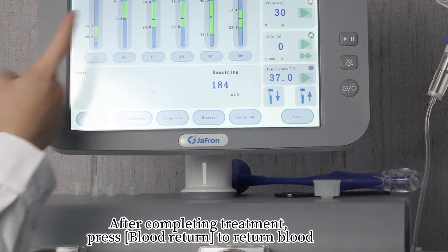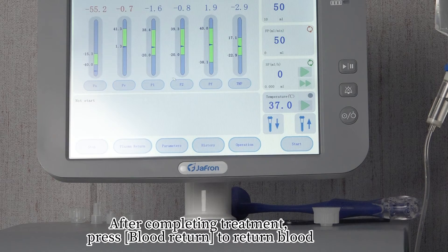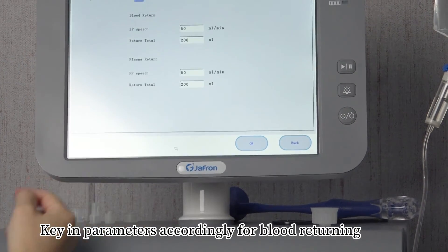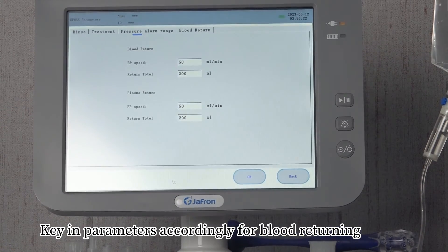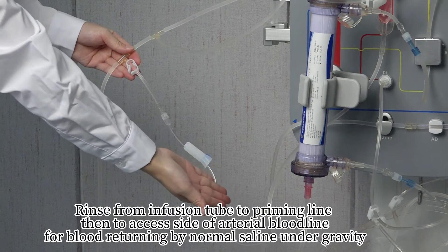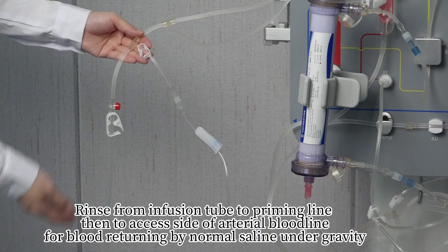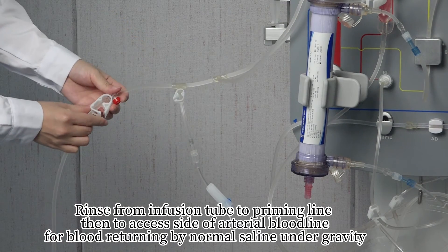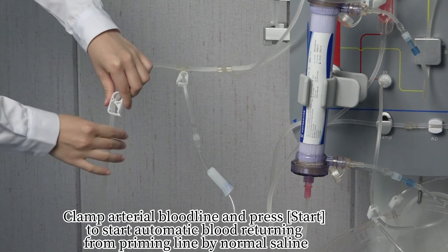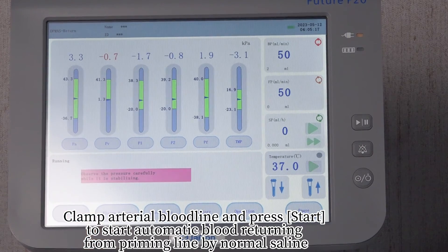After completing treatment, press 'Blood Return' to return blood. Key in parameters accordingly for blood returning. Rinse from the infusion tube to the priming line, then to the access side of the arterial bloodline for blood returning by normal saline via gravity. Clamp the arterial bloodline and press 'Start' to begin automatic blood returning from the priming line using normal saline.